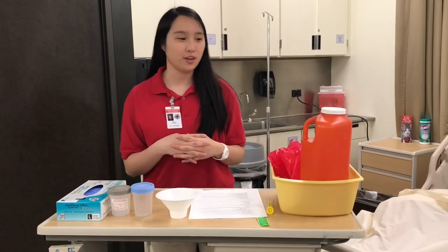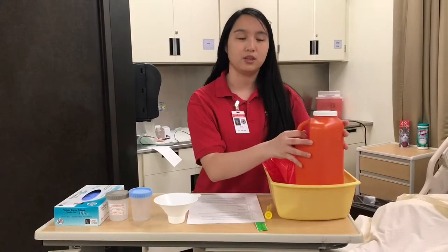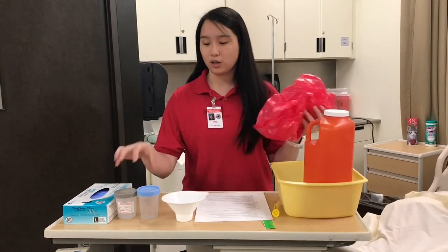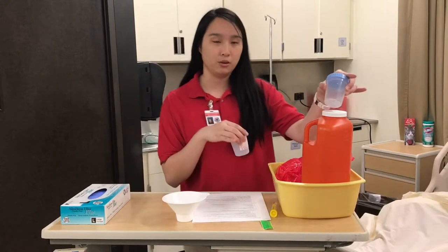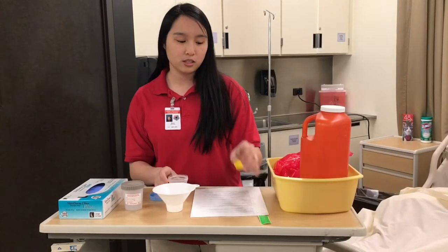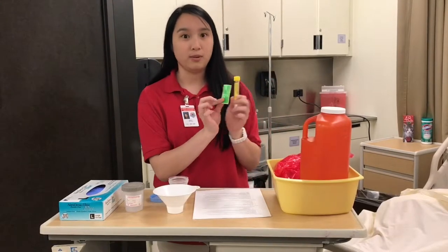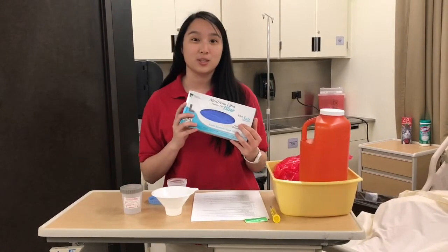Here are the supplies we need for the 24-hour urine collection and straining the urine. Here's a 24-hour urine jug to collect the urine. Here's a basin that we need to put in ice to keep the urine cold. We also need a biohazard bag for contaminated items or urine specimen containers. We also need urine specimen cups, a strainer to catch any stones, a specimen container for any stones found, and a label with the patient's identifying factors. This is a clean technique so we also need gloves.